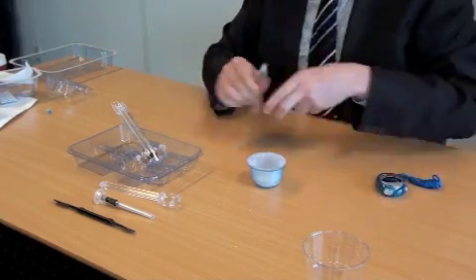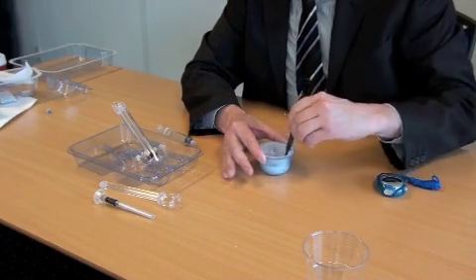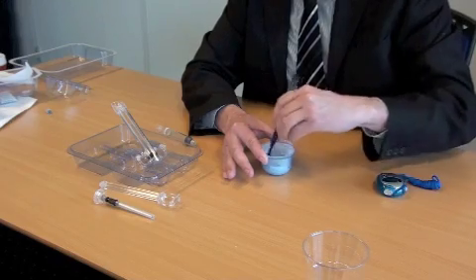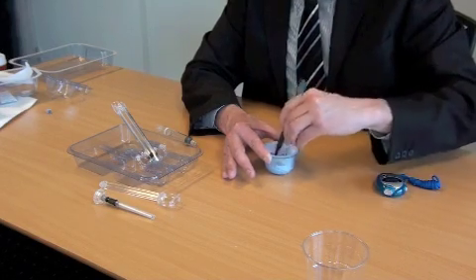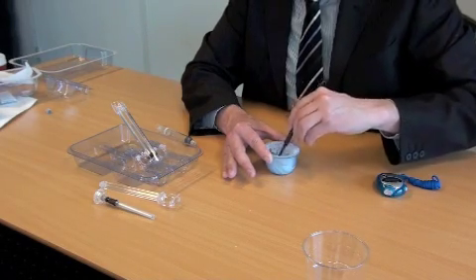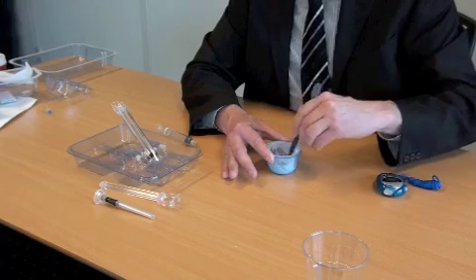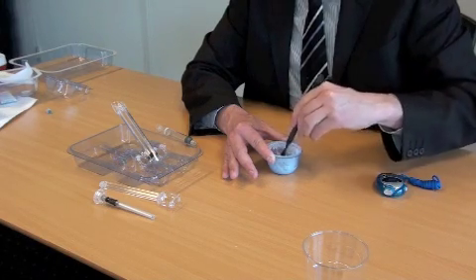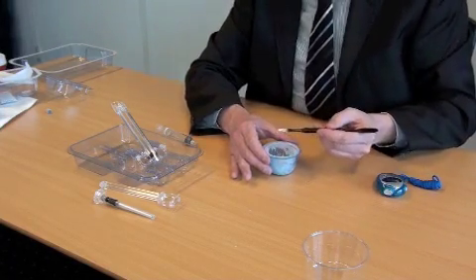I'm going to start the stopwatch. I take the spatula, and for the next 45 seconds we have to make sure that we mix it with thorough circular motions. And it looks like it's a dry mass, but when you continue to mix and you really scrape it together, so you make one mass of it, you will actually see that it starts to become liquid. We are now at 30 seconds. You continue till you have mixed it for the full 45 seconds. Okay, now it's 45 seconds.